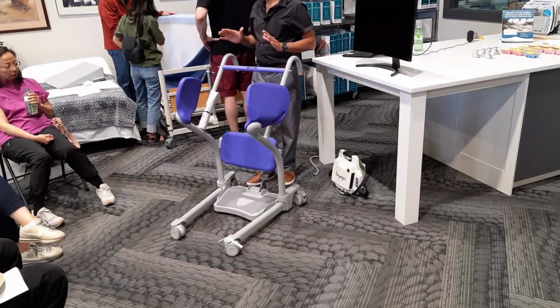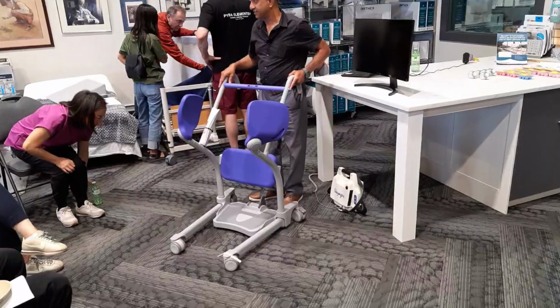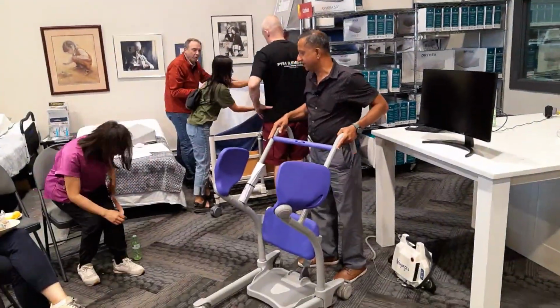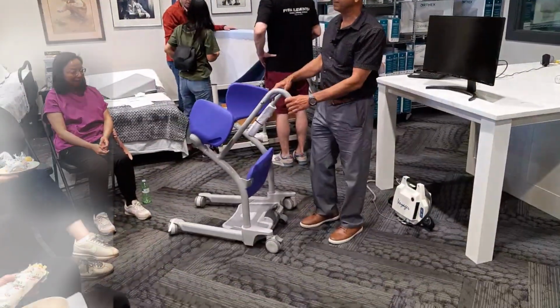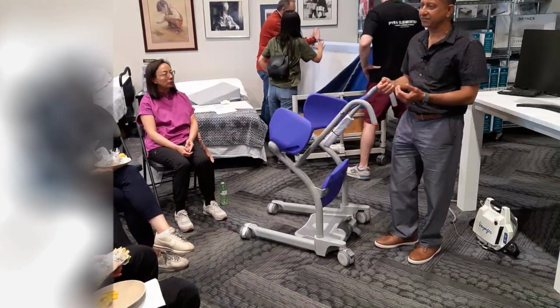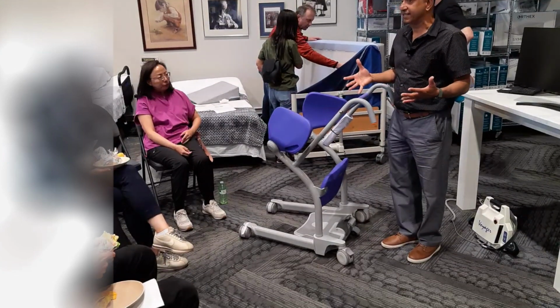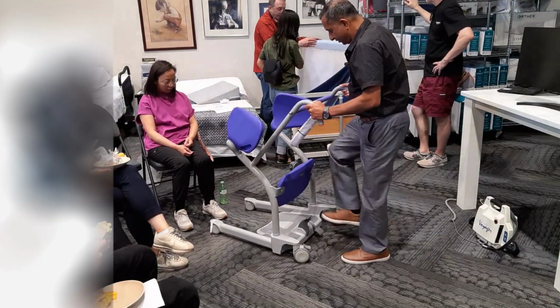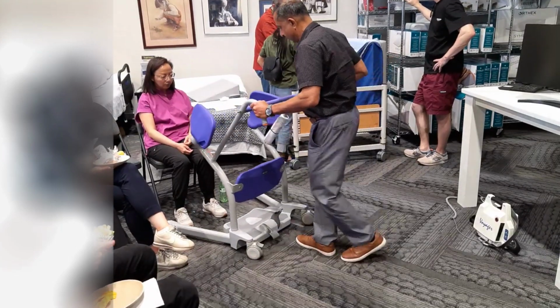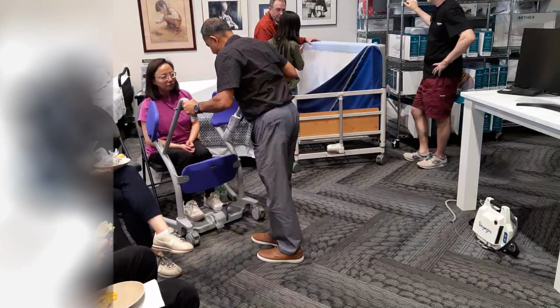So for example, are you ready? Can I use it on you? Sure. So just be in the seating position. You don't need to stand. The basic concept is Barb is on the chair. Now she has a tough time standing up and staying stable when she's standing up. So what I'll do is open the base here, bring this device in, and ask Barb to lift her feet.